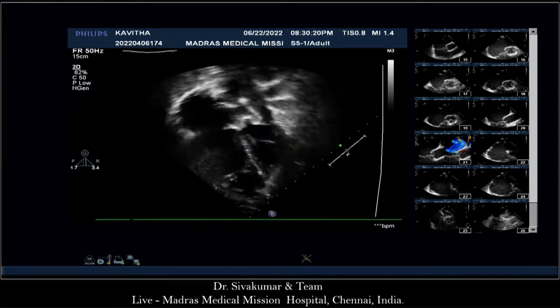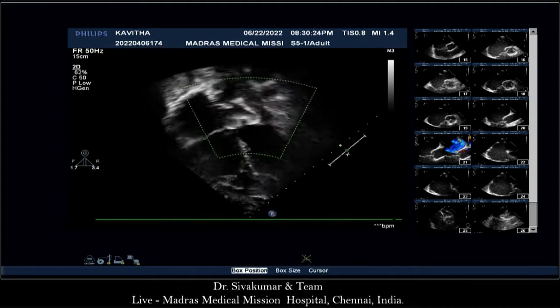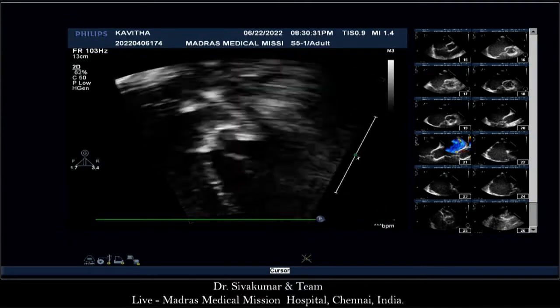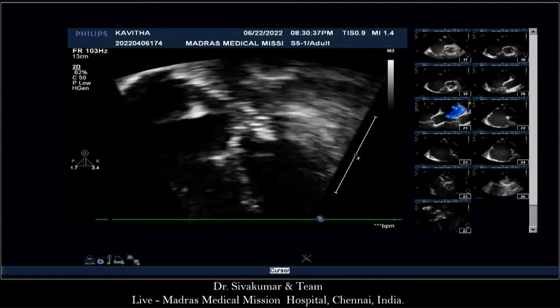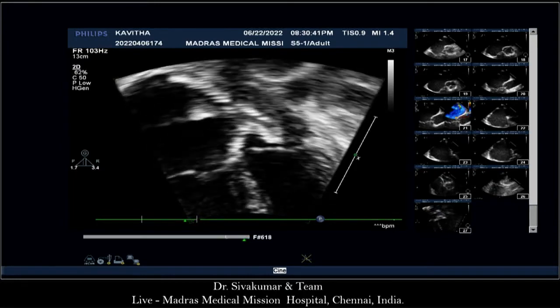I don't like this picture. I'm sorry, but it's too big for me. Yeah, this is a very big device. We've got to make sure you're not just looking at one area. It's a whole 29 millimeter, and half of that diameter is where the device is sitting. It's very important to look at it. The left atrium, yeah, I mean, it's touching it there.